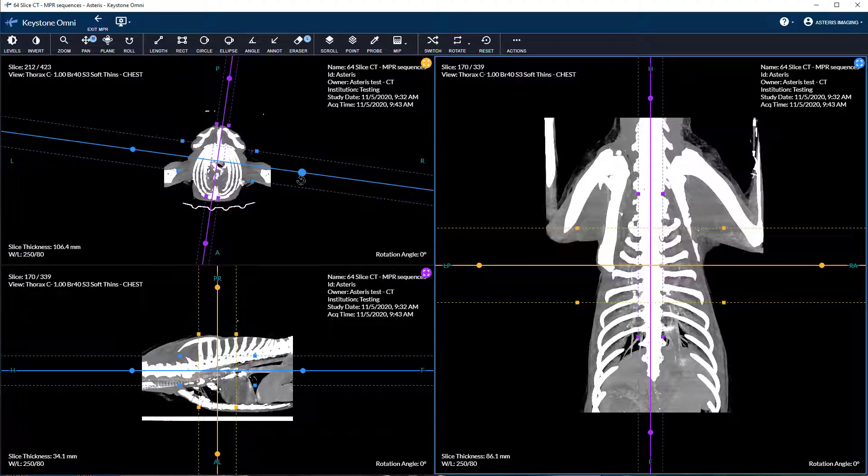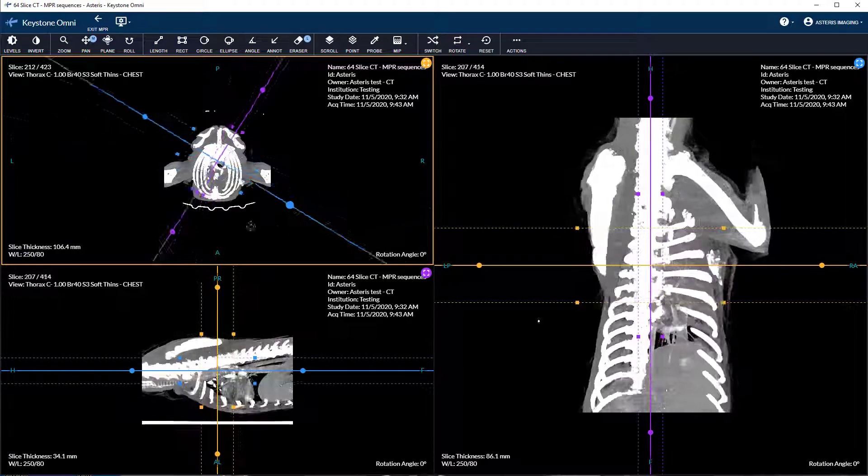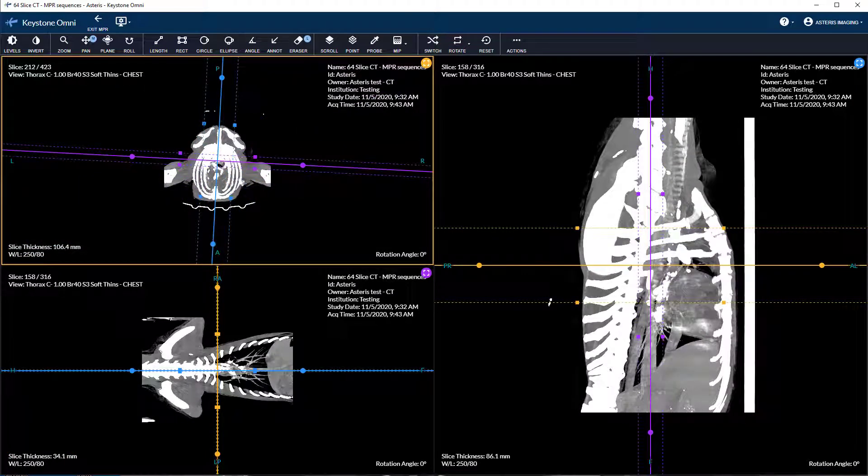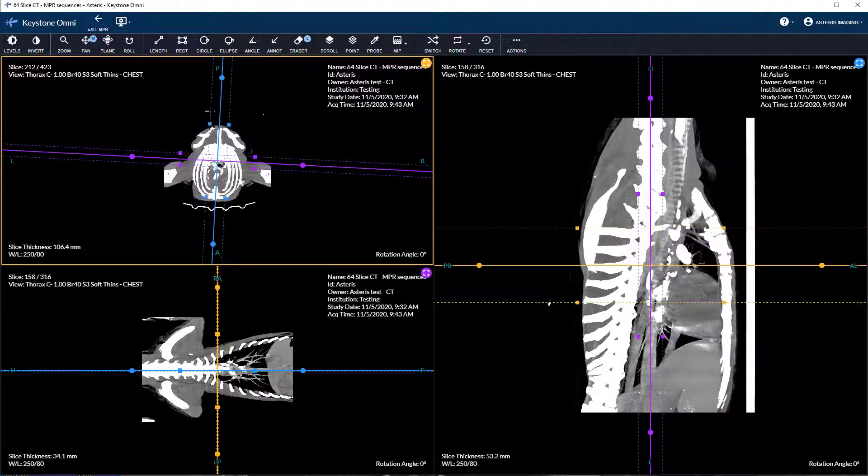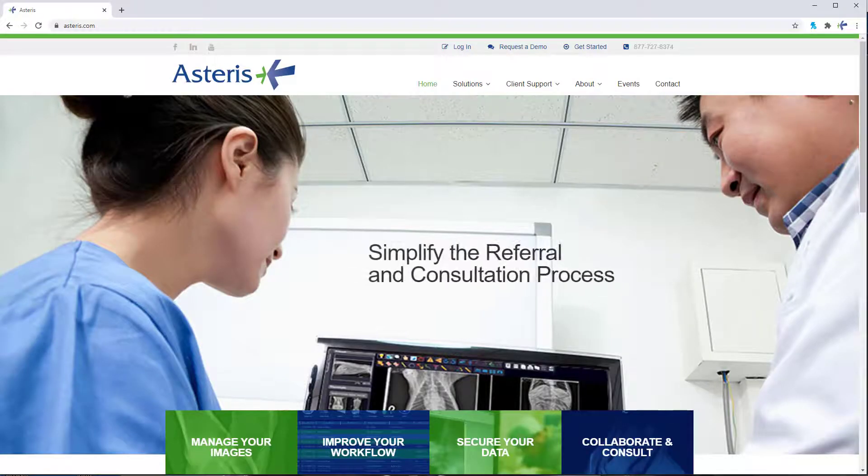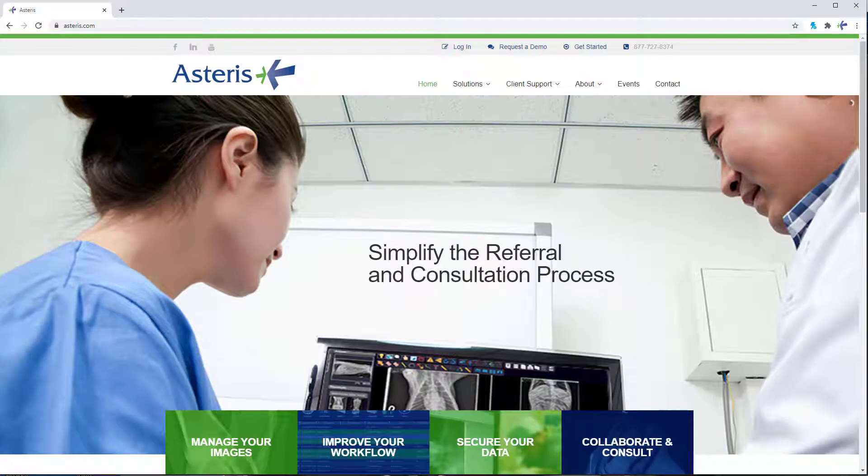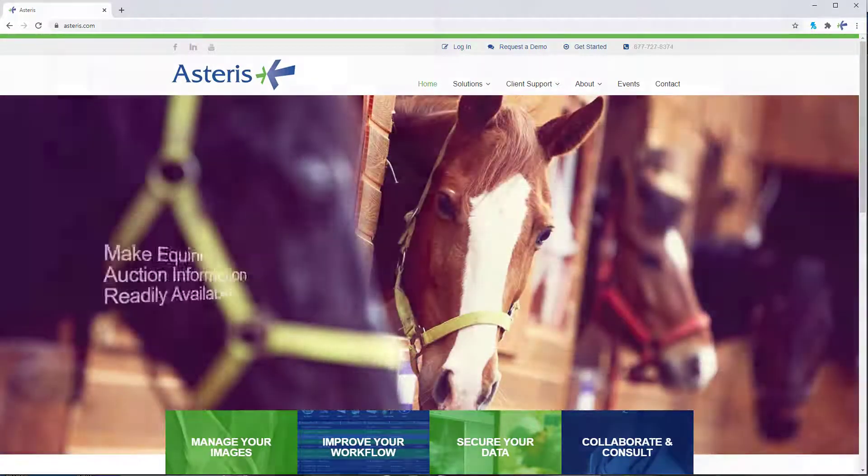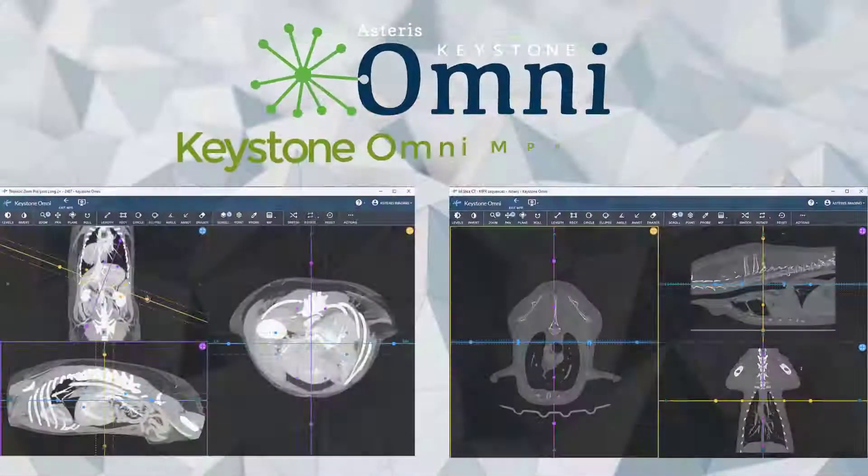That's going to conclude this tutorial on Keystone Omni 2D Multiplanar Reconstruction. Be sure to check us out at www.asteris.com and tune in for more tutorials and guides.